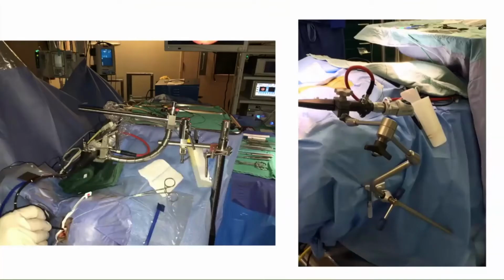For people who are really experienced, and that does not include me, you can hold the flexible endoscope in your hand, but generally speaking, what's most useful is to use this clamp system, which is what we use here. This is our setup here at AFCH. Other places have this. Same principle.